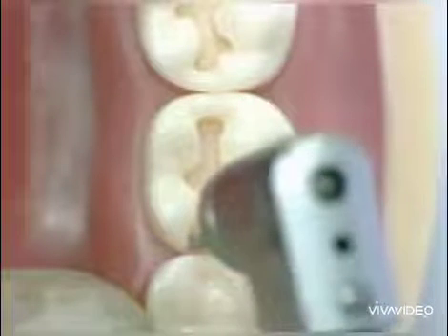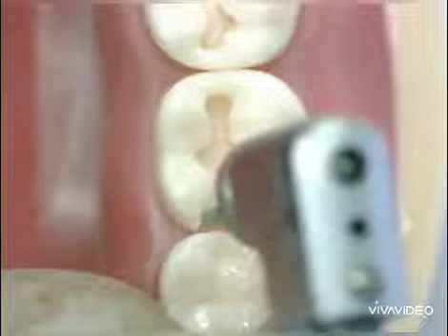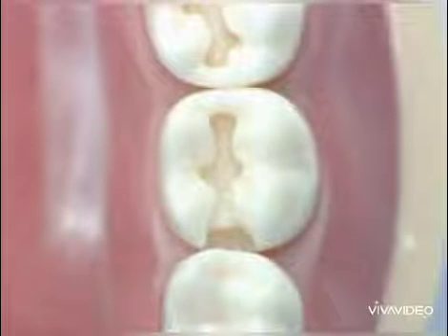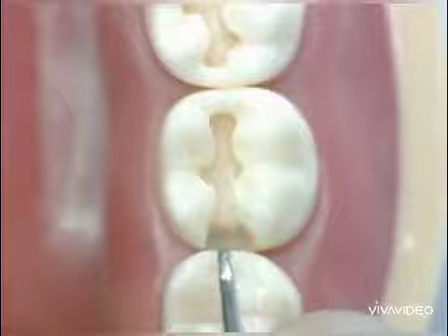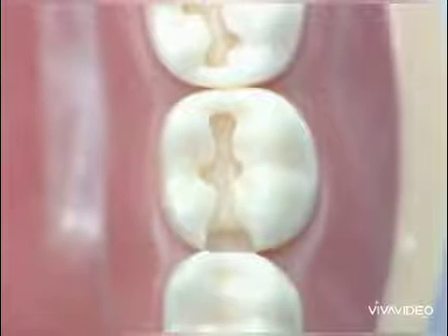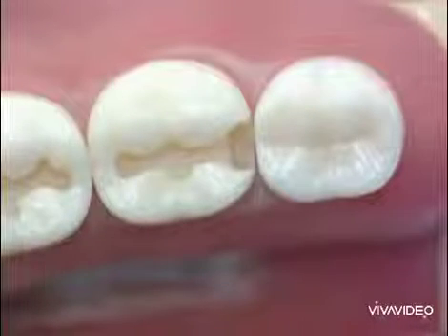Finish the cavity with a fisher bur. The fisher bur is inclined buccally to make the lingual wall of the box converge occlusally. This is a gingival margin trimmer used to do beveling of the axial-pulpal line angle and the gingival margin. This is the beveling of the gingival margin.